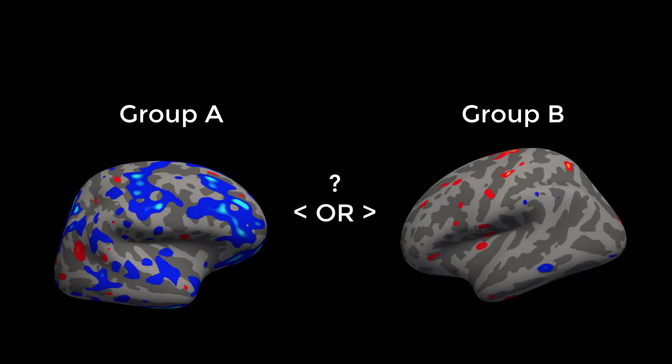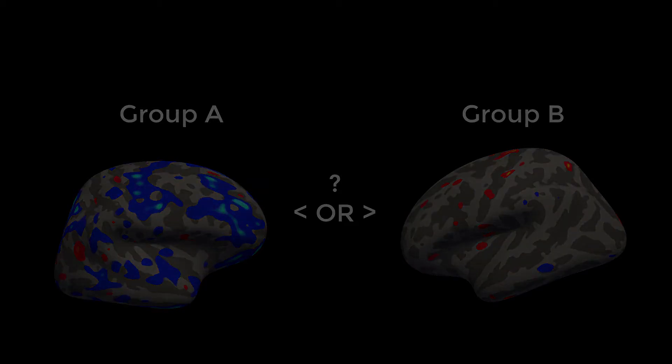We've now reached the stage of group analysis. For example, does Group A, on average, have more or less cortical thickness than Group B, and where? The following commands will allow us to answer those questions.